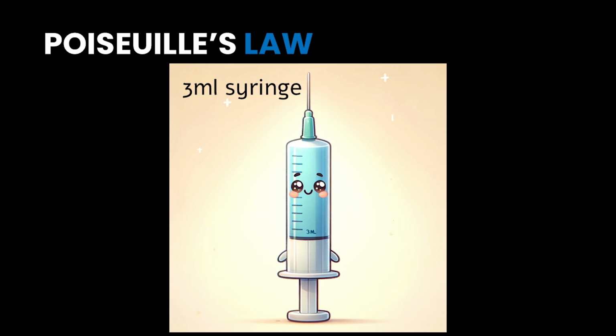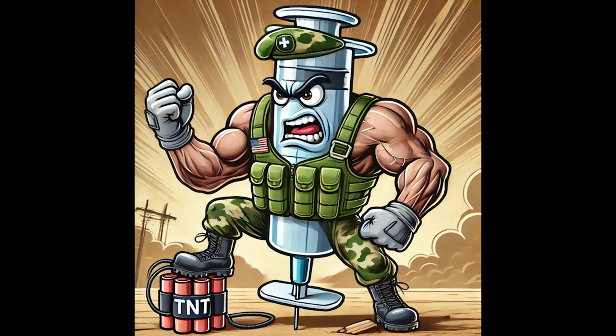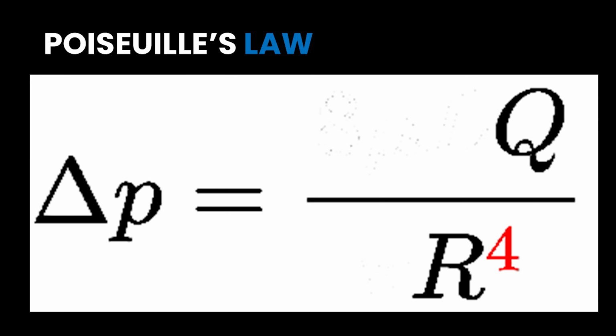But when we look at a 3cc syringe, we're like, oh, it's so cute. It's the little puppy version of a 10 milliliter syringe. We use it for our pediatric, right? No, completely wrong. It can output so much more pressure, and I'm going to show it to you.